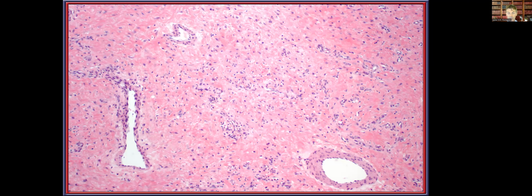Recognize that with time, you may have a remarkable deposition of collagenous tissue, here being deposited in a fibroblastic type distribution and giving you a keloid-like collagen deposition in some areas. Embolic material, again, can be seen, and here you can note the vessel is filled with the foreign material. So whenever I see this, at least an index of suspicion for a vascularized tumor should be considered.